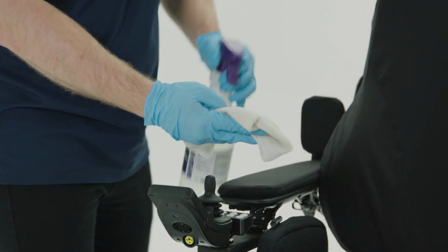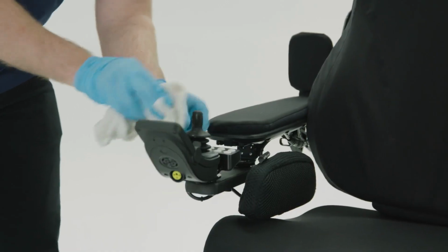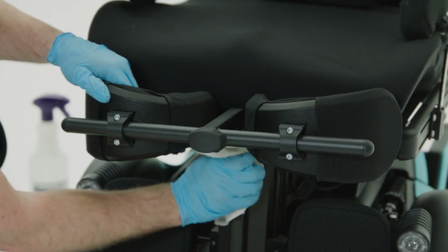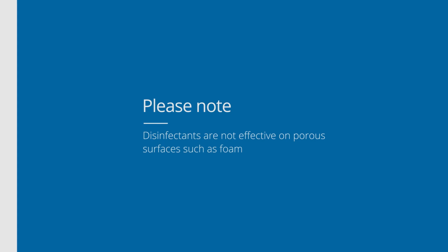After thorough cleaning, surfaces which come into direct contact with the user or caregivers can be treated with an EPA-registered disinfectant. Always remember to follow the manufacturer's instructions for the product you are using. Please note that disinfectants are not effective on porous surfaces such as foam.